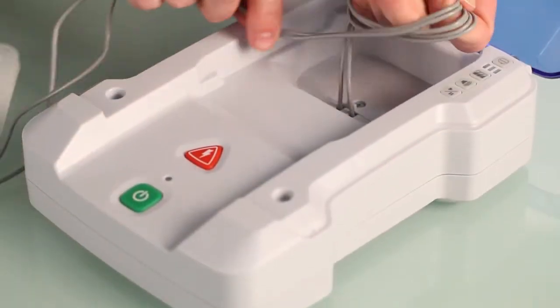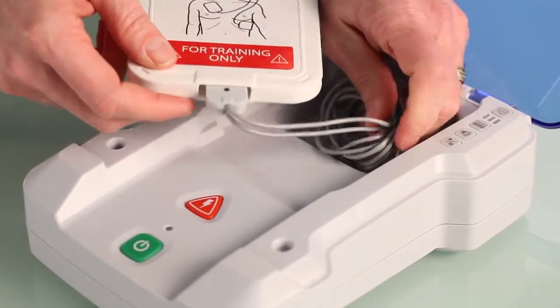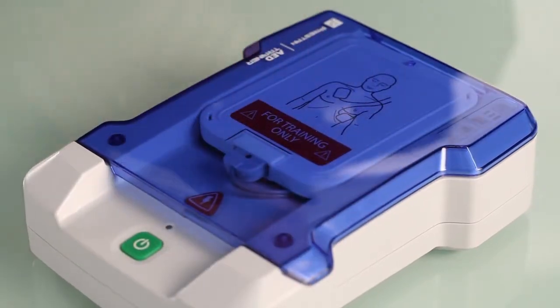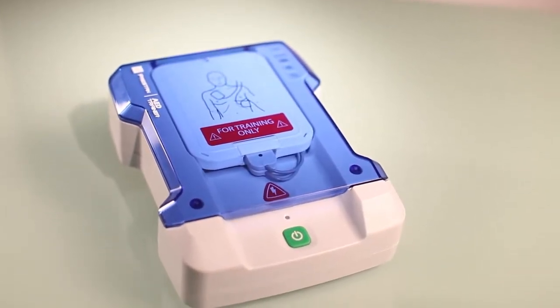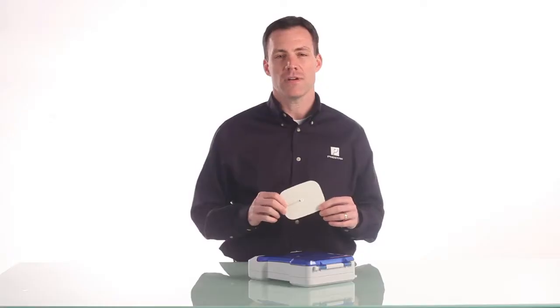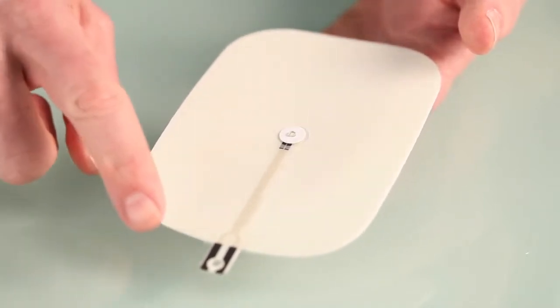When you're done, wrap the cord around your hand and put the cord in the unit underneath the pads case. Preston has developed a unique pad sensing system that automatically detects when both pads are in place so that the AED trainer can progress to the analysis phase. The pad sensing system is activated by the sensor button on the adhesive side of the training pad.